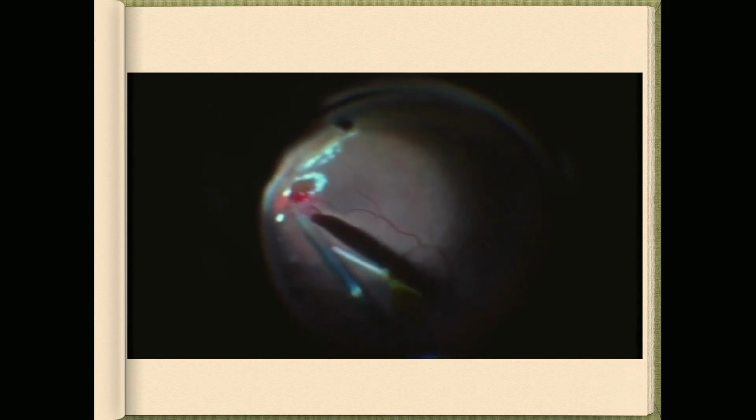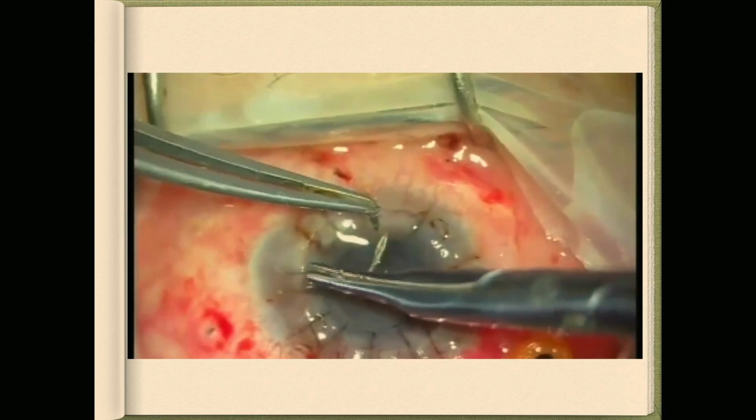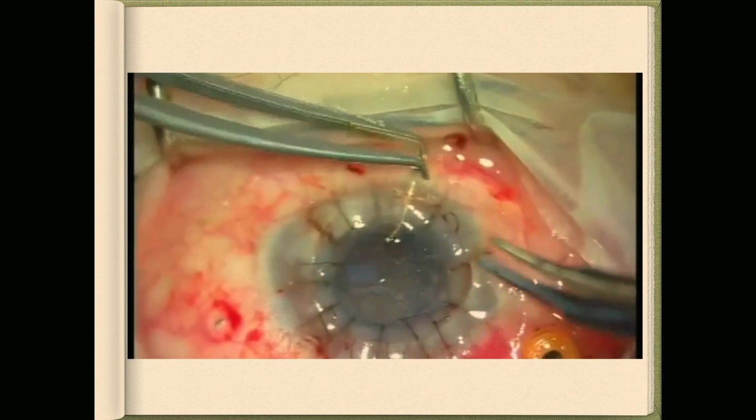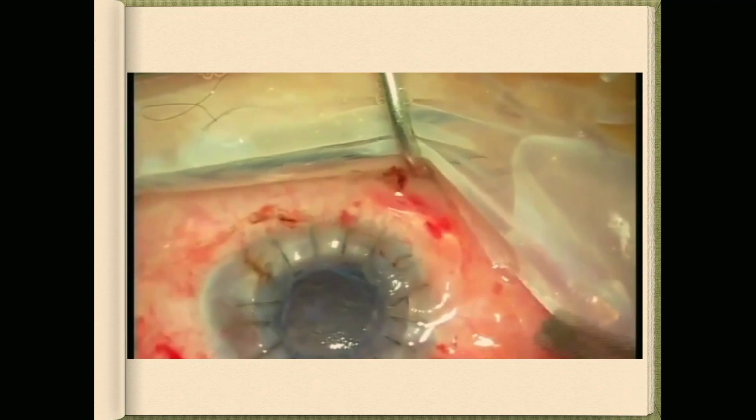My assistant puts the light directly on the K-Pro. There is no need for putting in an extra trocar and doing bimanual surgery like this and doing laser, and it's very nice visualization, as we see. And after that, putting in the new cornea button.